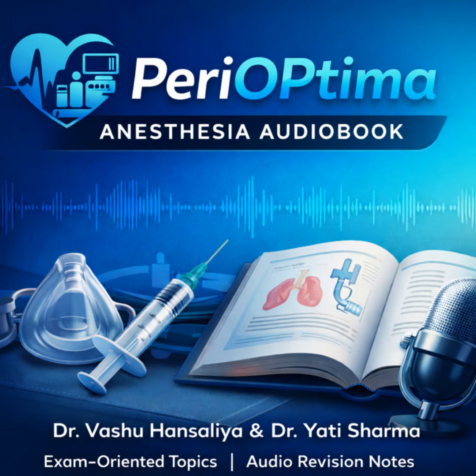How does the Tech 6 Plus overcome this? And what are the specific numerical safety parameters we must remember for the exam? The Tech 6 Plus is an electrically powered, temperature-controlled vaporizer. It eliminates the cooling problem by removing the fresh gas flow from the vaporization process entirely. The key safety mechanism is an internal electrical heater that keeps the liquid Desflurane reservoir, the sump, at a constant temperature of 39 degrees Celsius. 39 degrees. And this heating creates a constant high vapor pressure of 2 atmospheres, or 1,500 mmHg, within that sump. And those numbers, 39 degrees C and 2 atmospheres, are high-yield viva facts.